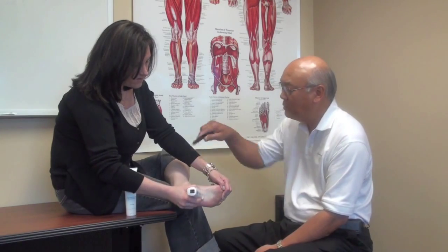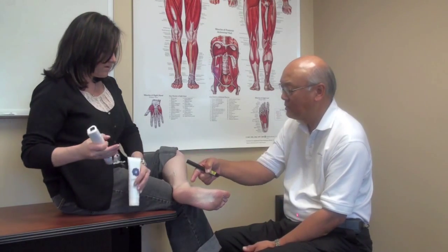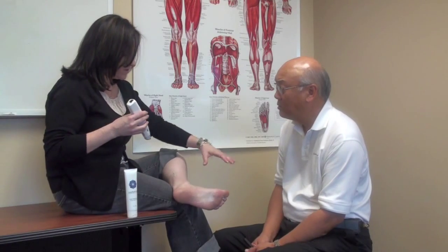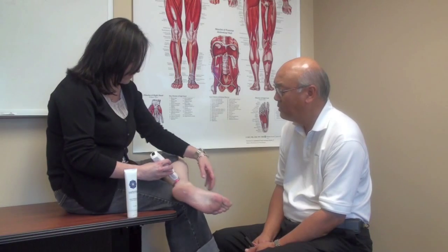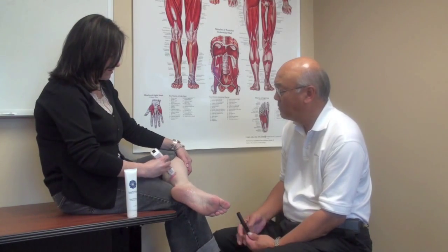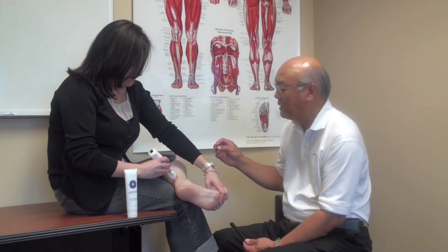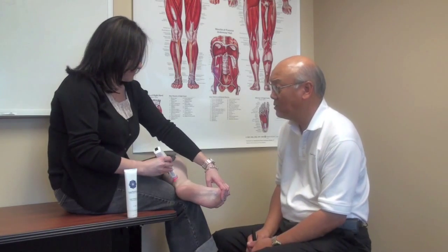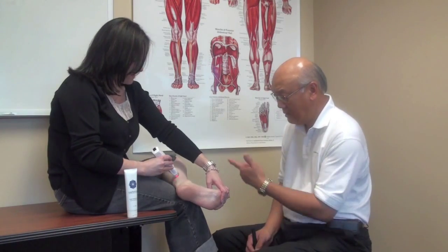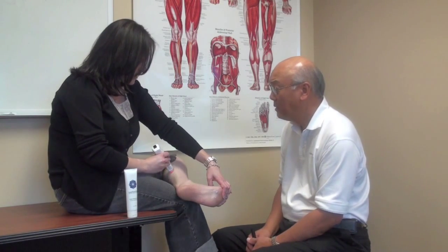How about when you go up in your calf muscles? It's the same thing because these muscles can also get tight and start pulling on your foot. You can relax it and then pull, relax and pull. What it does is bring the muscles to the surface. If you have any trigger bands, you will pick them up because they're usually a bit more sensitive. Tell me what you feel up there. It feels great — I'm feeling a couple of trigger points.